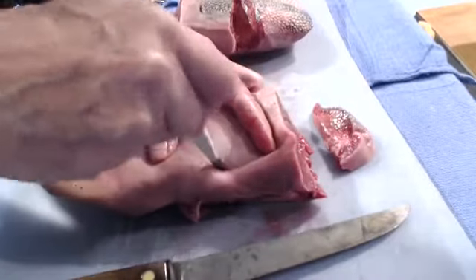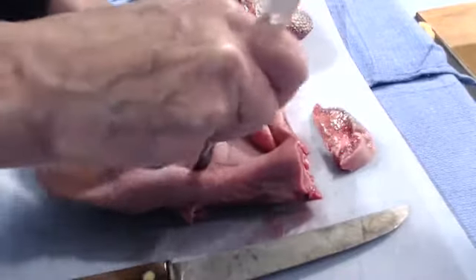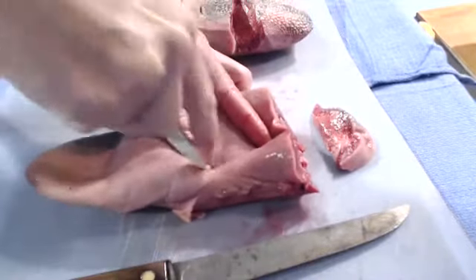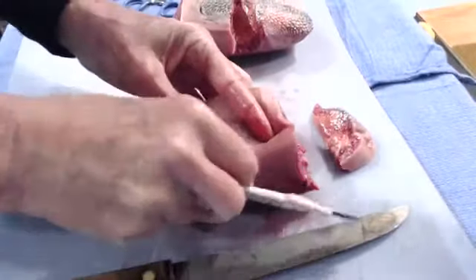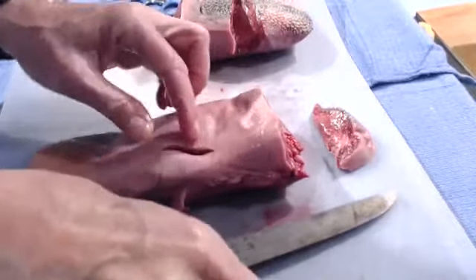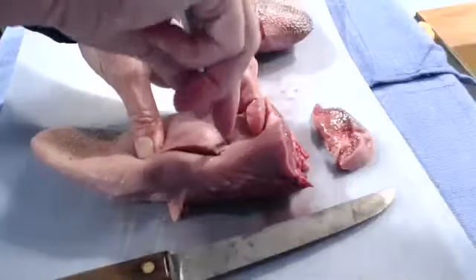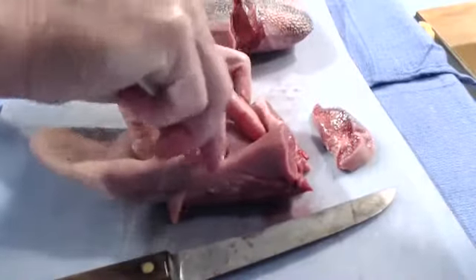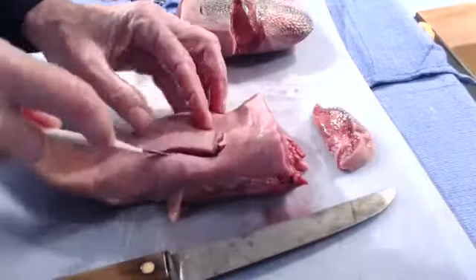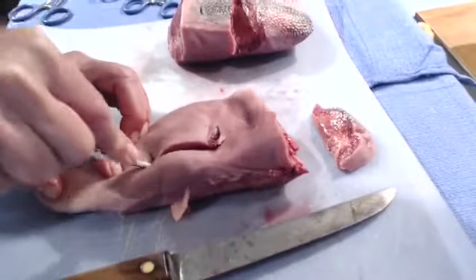Sometimes you get a pocket that forms, yeah, beef tongues are tough, and I want to be careful with my scalpel. There we go. Sometimes there's a pocket that forms, if this is the perineum and this is the vagina, just behind the hymen, and it may have little extensions that go back into the vagina. And leave little divots of hymen that have pulled away. So I'm going to make a model like that so that we can actually focus on that today when we're doing our repairs.